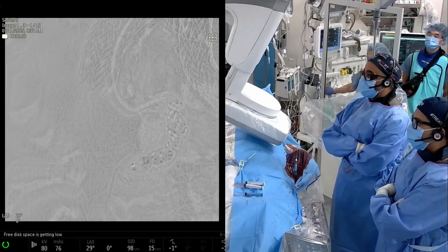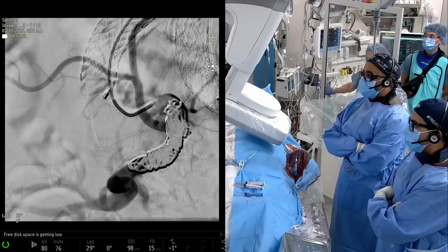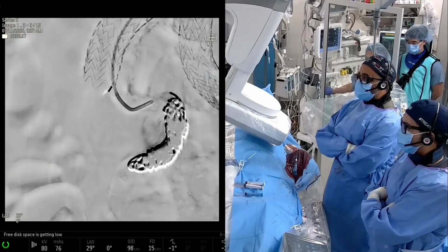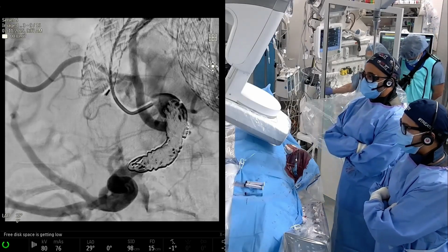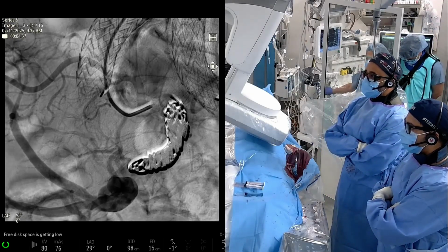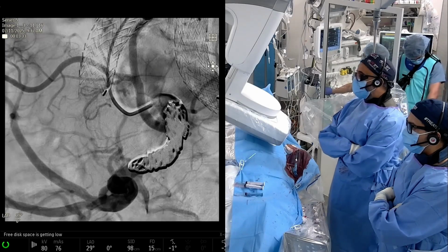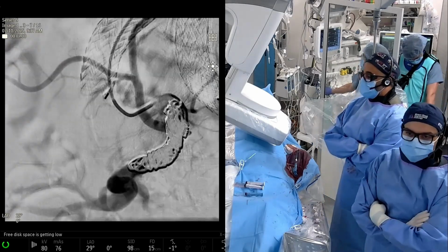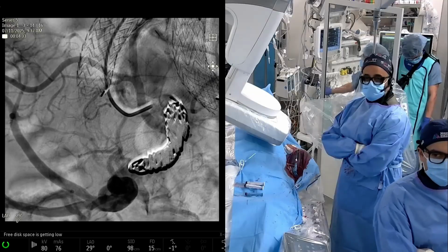Yeah. So you are going to go with the micro system? Yeah, I think I'm just going to go with the micro system and see if we get lucky, if we get into this little branch, because I think that's part of what's keeping everything kind of open. But we'll go from there. Yeah, some of it's just patience. You could also make the argument they're going to cover this anyway. Yes, exactly. And that's often what I do.